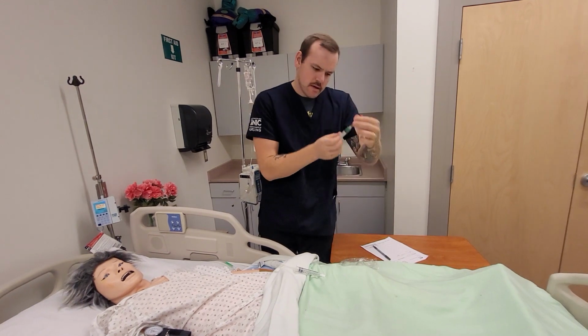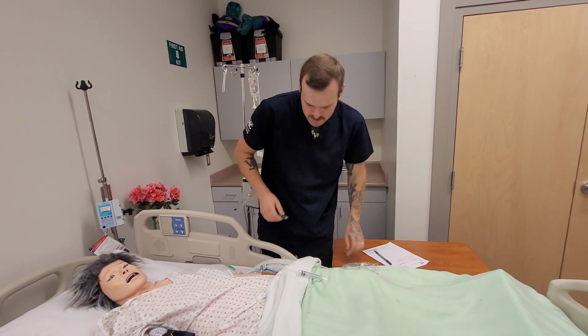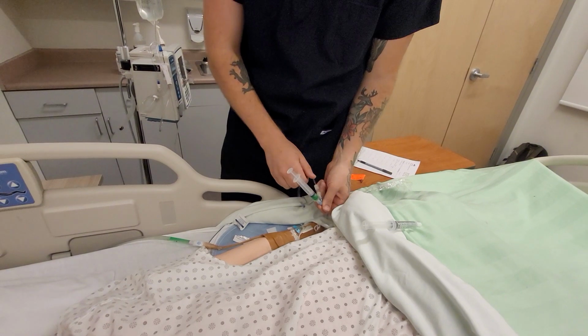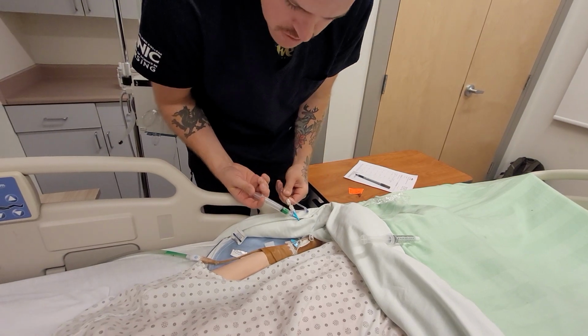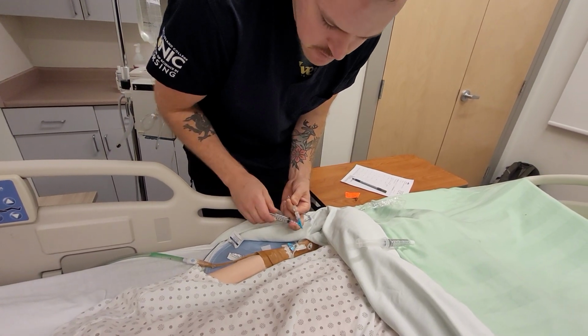Okay, 2.5 mils. We're going to affix to the closest Y site here. We know that this IV is patent because it's just running fluids, so we're not going to be concerned about having to flush for patency. I don't see any signs of infiltration. We're going to be pushing this med over 30 seconds. That 2.5 mils our dose.